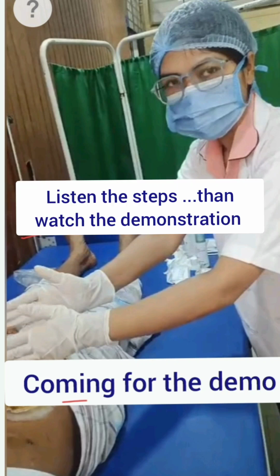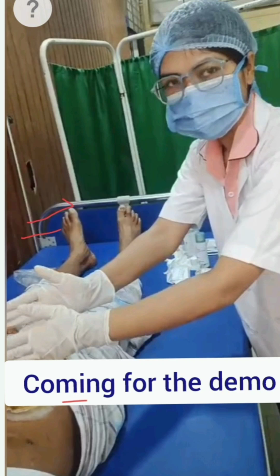I have washed my hands, so that it will prevent infections to the patients, then I have positioned the patient comfortably. So I have given the patient a lying down position. After that, I have put on the disposable gloves so that it will maintain hygiene and prevent infection. Then I have removed the old stoma bag slowly, peeling the edge slowly from top to bottom and supporting the skin. Then I have disposed the used bag properly.